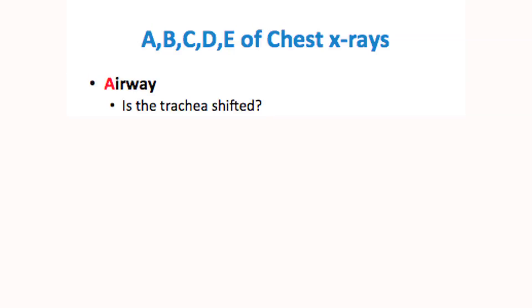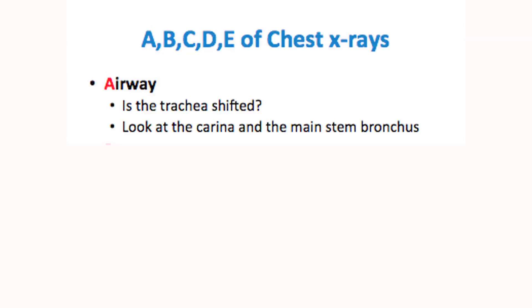Now we're going into the ABCDEs of chest x-ray interpretation. A stands for airway. Number one: look at that trachea — is it shifted? The trachea can shift if you have atelectasis in the upper lobe, a pneumothorax in the upper lobe, or a large pleural effusion pushing the trachea one way or another. Always look at the trachea and follow it down to the carina. Especially if a patient has an endotracheal tube, make sure it's around two to five centimeters above the carina. And while you're there, take a look to see if you can define the right and left main stem bronchus.